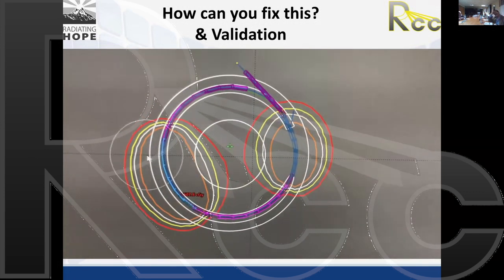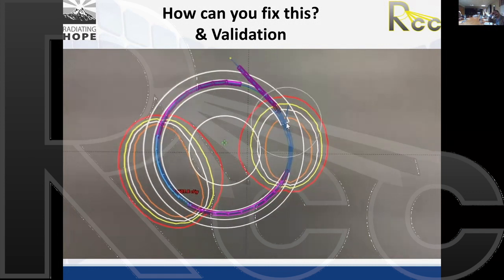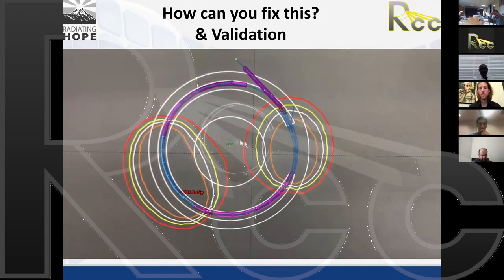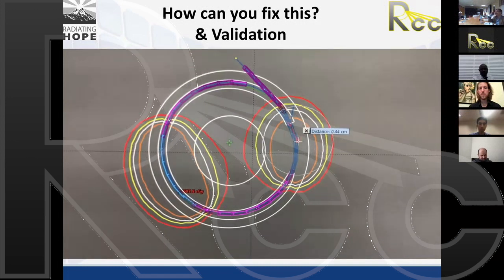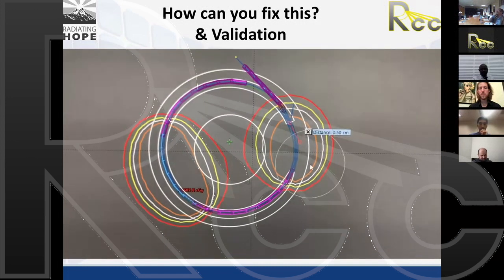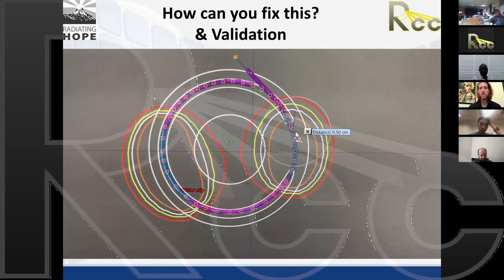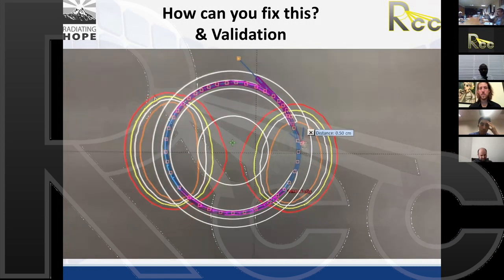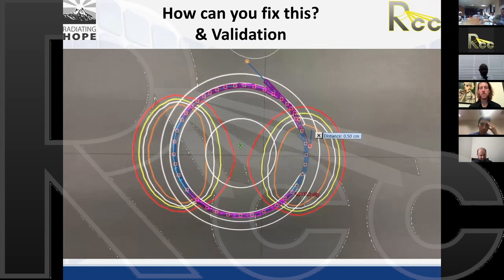And notice our first reconstruction point is here. So if we do a trick and we shift this first reconstruction point by that offset determined in commissioning, so in this case it was 5 millimeters, we shift it 5 millimeters. Now look, we have a symmetric distribution once again. So this is the other option.